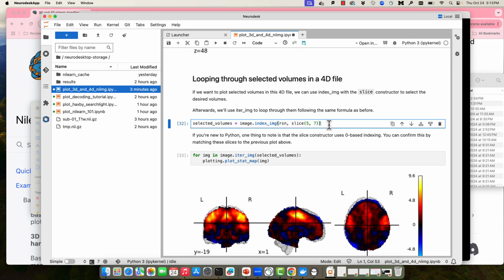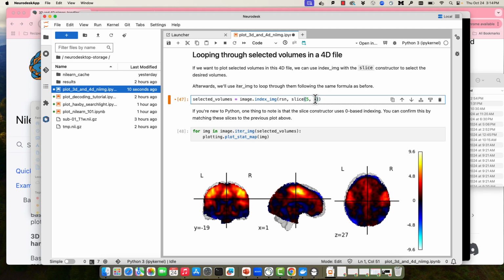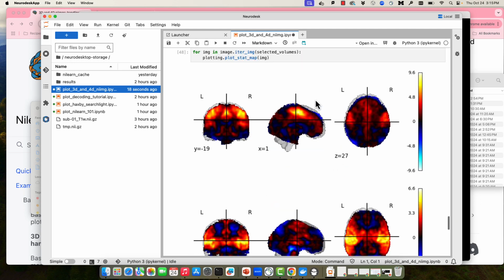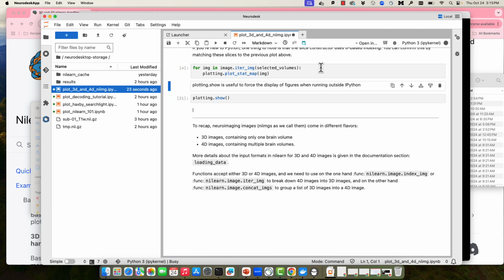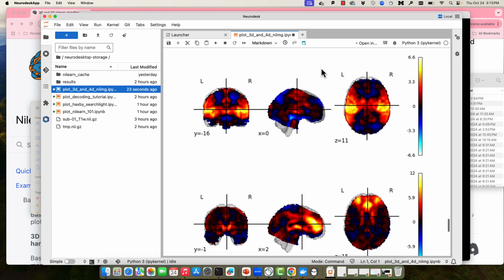And then lastly, this next block, if you just want to restrict your focus to a couple different networks, notice the template they give you is 5 through 7, I believe. So if I wanted to show 5, 6, and 7, I would change that upper bound. Yeah, that should show me 3 plots, I believe. Yeah, there we go.